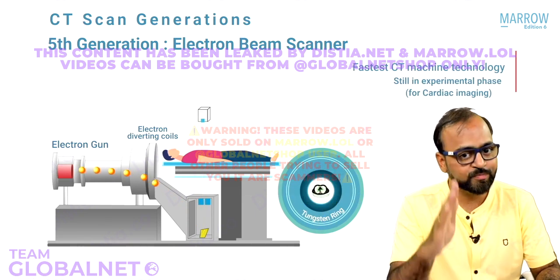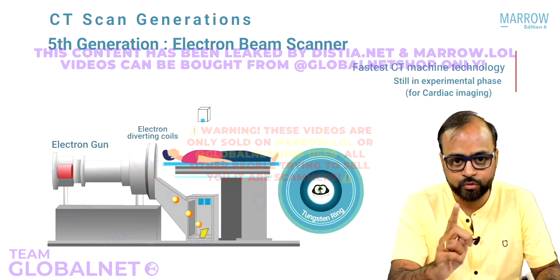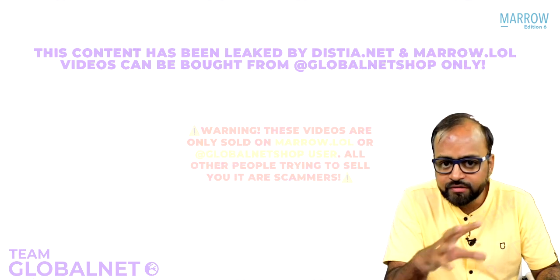However, it is still in the experimental stages for cardiac imaging, because the heart is beating. We need a very fast imaging modality. That is where its use is being explored. Now, so we have seen 5 generations.